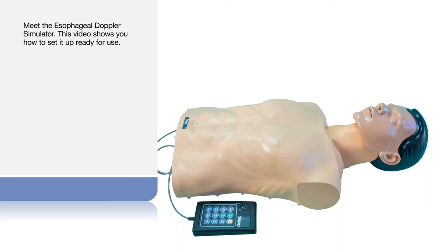Meet the esophageal Doppler simulator. This video shows you how to set it up ready for use.